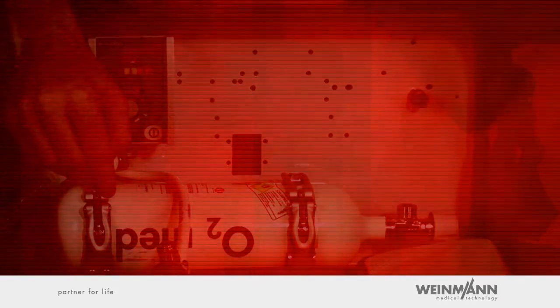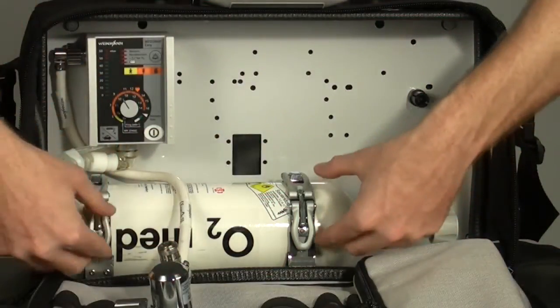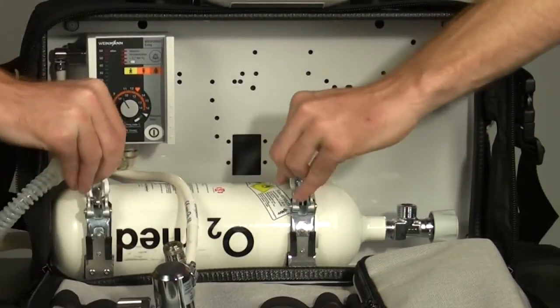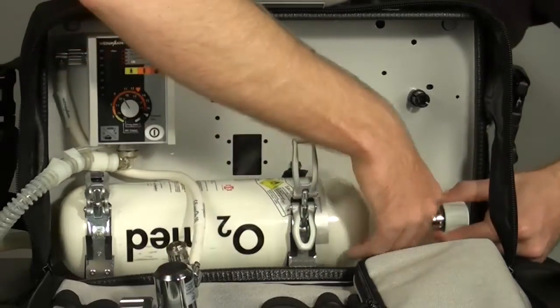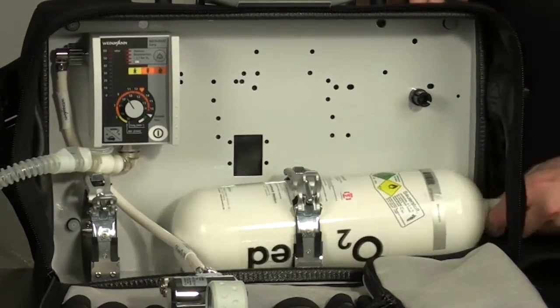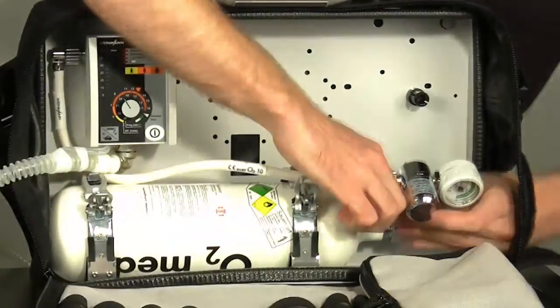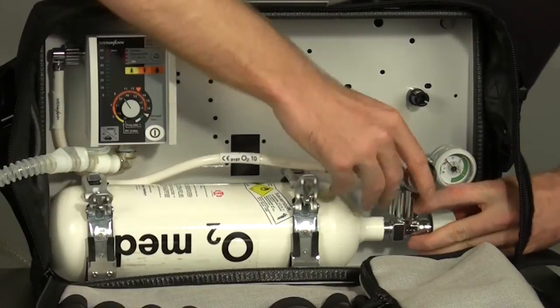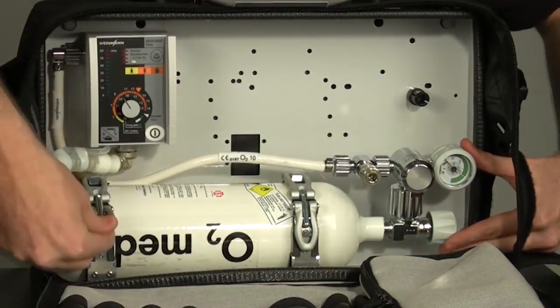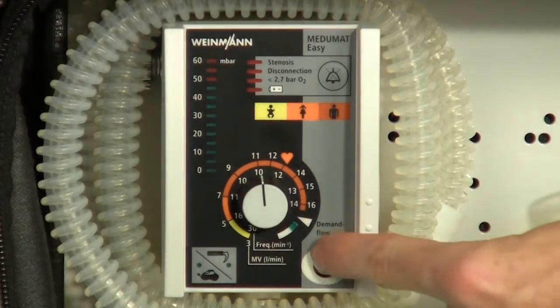Caution: if highly pressurized oxygen escapes, there is a danger of explosion. It is therefore extremely important that the pressure reducer screw connections and valve threads are not treated with oil or grease and do not come into contact with oily cleaning cloths or greasy fingers. Before you open the cylinder brackets, make note of the point at which they are latched — this will make it easier to close them again. To refasten the oxygen cylinder and pressure reducer after the cylinder change, simply follow the steps in reverse order. Be sure to position the pressure reducer so that the gauge is easy to read. Now Mejumat Easy is ready for use and mechanical ventilation can be resumed.